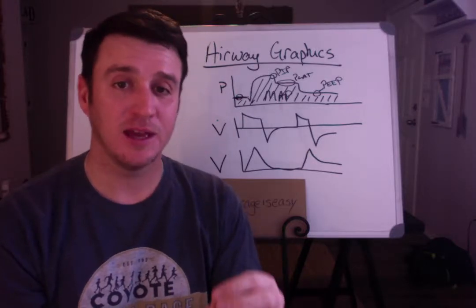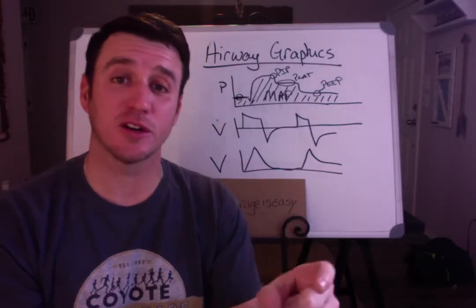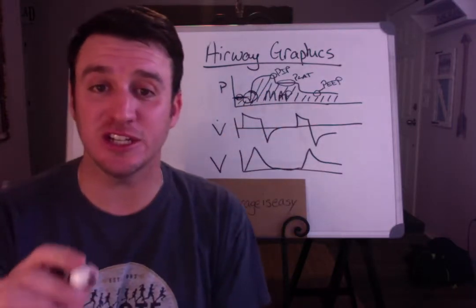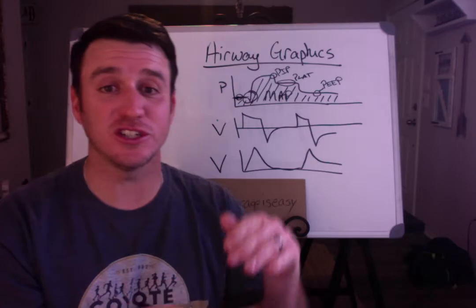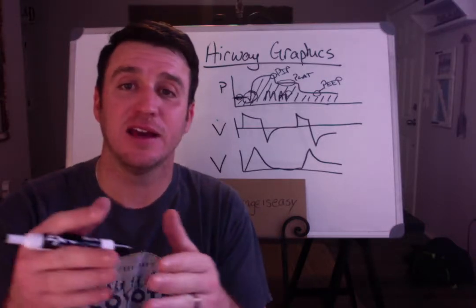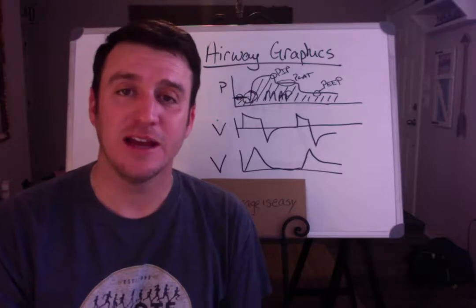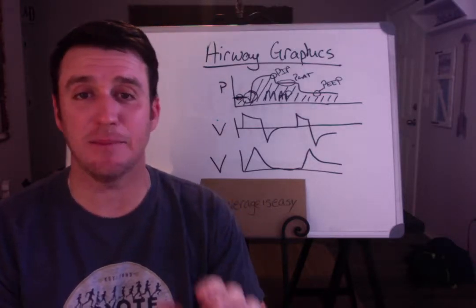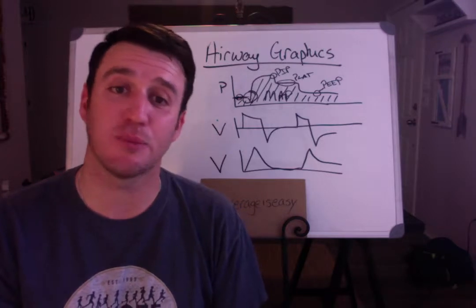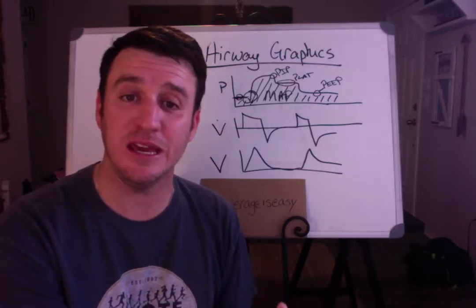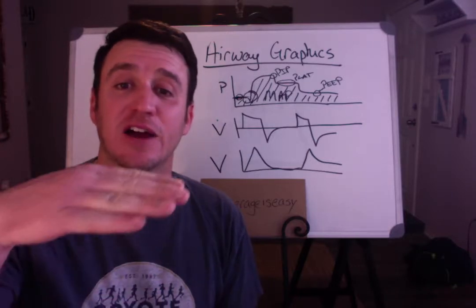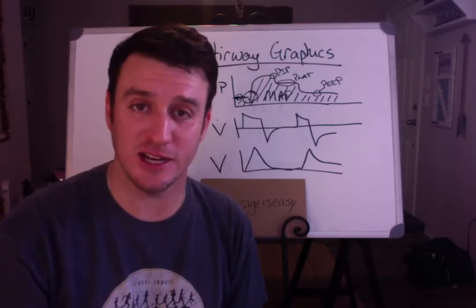The pressure waveform is also beneficial for understanding when your patient is triggering or not triggering the ventilator. If you see a negative deflection like here, that's a patient trigger. If it's flat and just rises, the patient did not trigger that breath — it's a time-triggered breath initiated by the mode of ventilation. This gets deeper with asynchrony, but basically: the diaphragm drops, pressure drops, and the breath is initiated.